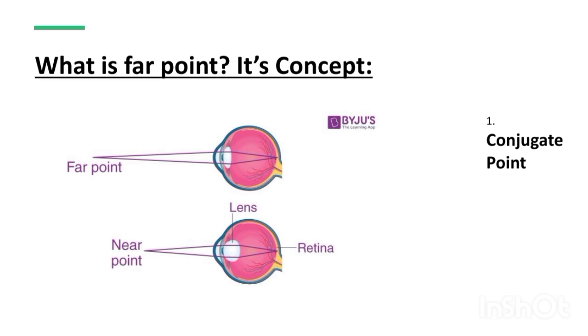Why does the far point come into the concept of retinoscopy? Let us remind ourselves of the definition of any refractive error like hypermetropia or myopia. When you read, you probably remember that the parallel rays of light coming from infinity, like this, and at the end of this definition there is one group of words: with accommodation relaxed.